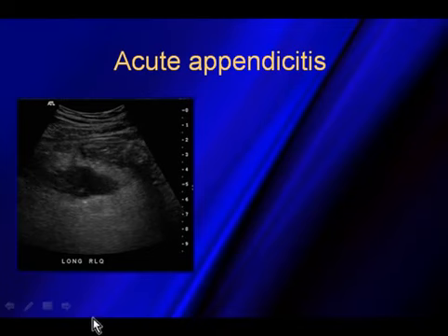This is a patient that, as we call, has on their winter coat. You can see even before we get to the area of the inflammation, we're already at about 3 to 4 centimeters in depth. Sort of a key to remember, when you're using your high-frequency linear array transducer for any type of imaging, when you're trying to look at a structure deeper than 3 centimeters in depth, you're starting to push that transducer too far.